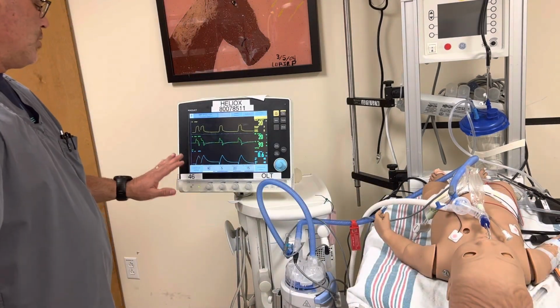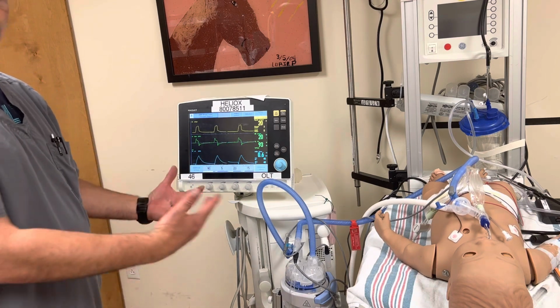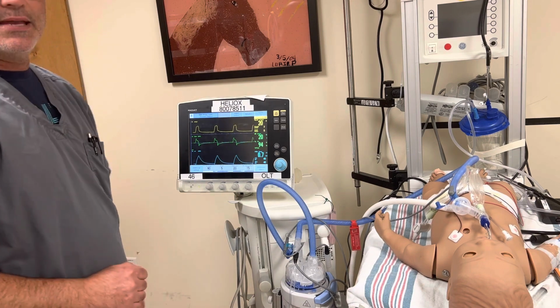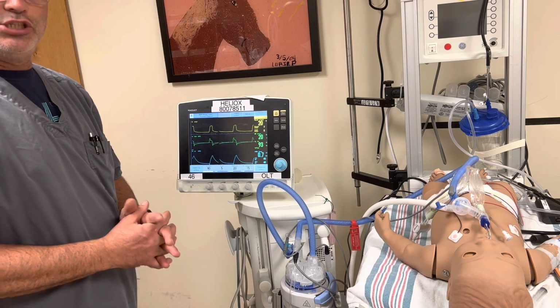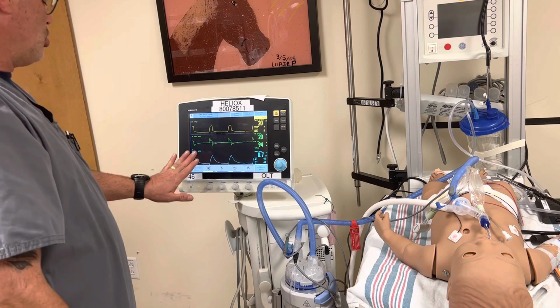Okay, so the leak is mostly gone. That's there because it's a mannequin. But the leak is mostly gone, so now I can progress further. Now, if the leak doesn't go away and it remains like that, I need physician guidance on setting anything, because I have this huge leak and that affects how we set the other settings. But we'll get to that. So my leak is fixed.